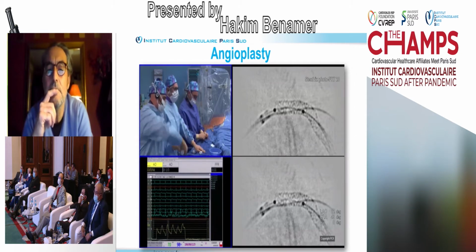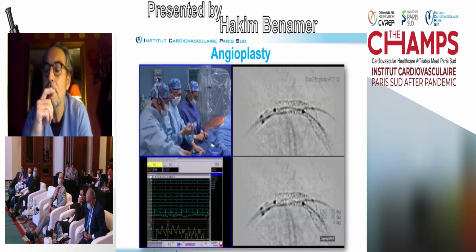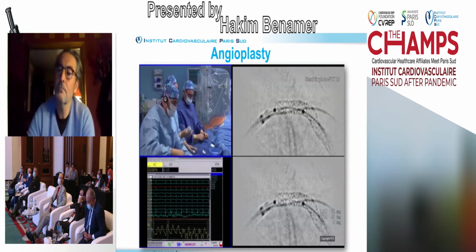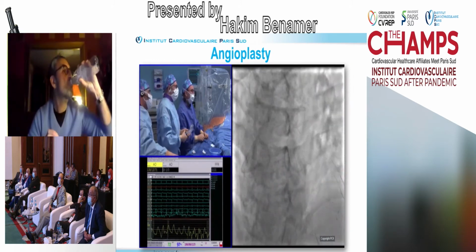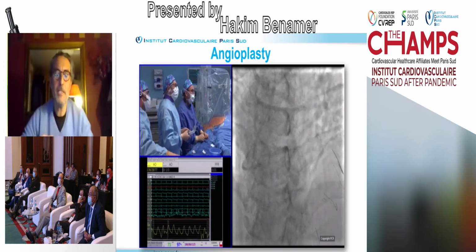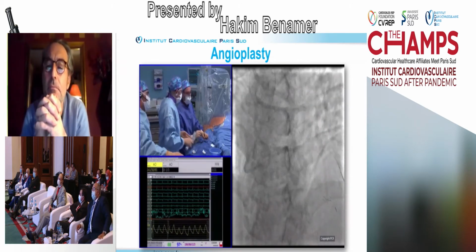Yeah. The Hakim Thierry, I think that Javier has got some useful insights on the case thus far to present to the main arena. So we'll let you work for a few moments. And Javier, okay, perfect. Please share some information with us. Thank you very much, Bernard.